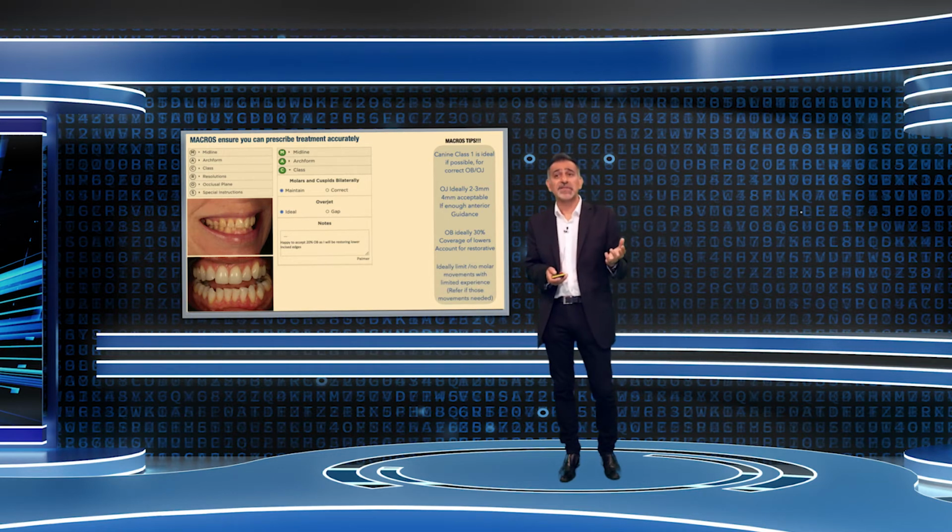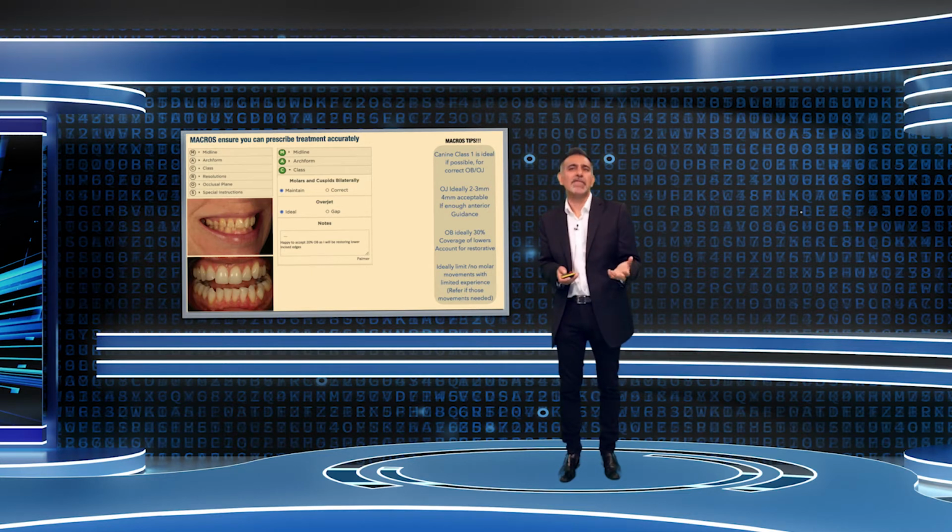And I would say, ideally, at an early stage, if you're a general dentist, try and limit the amount of molar movements that you are going to achieve, because molar movements on big ortho cases is a tricky thing to do. It doesn't mean you can't do it, but generally as a rule, particularly in IAS, we would say if there's a lot of molar movement needed, for an inexperienced dentist, you're probably better off just referring those cases.